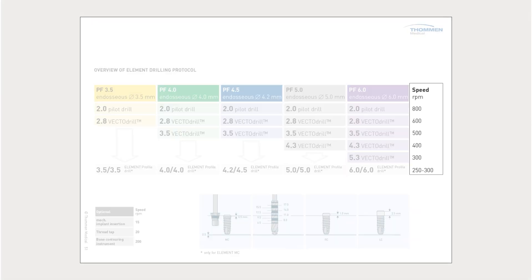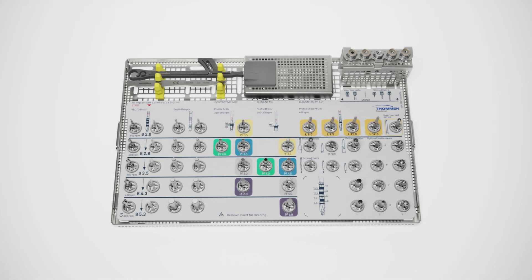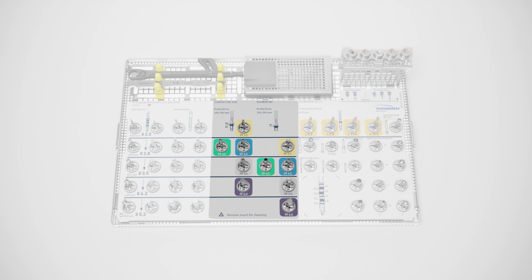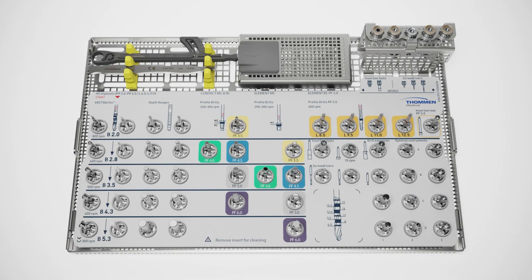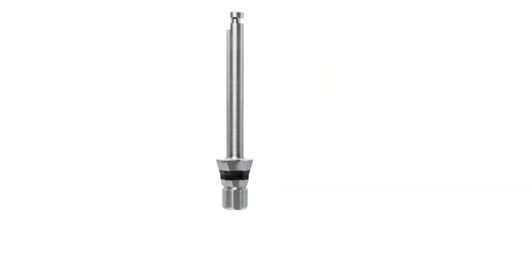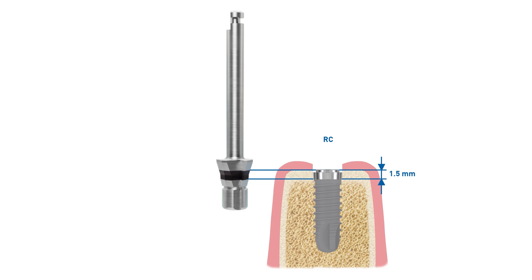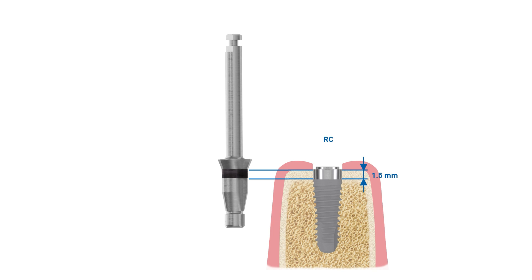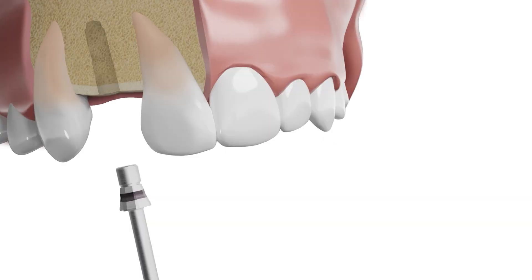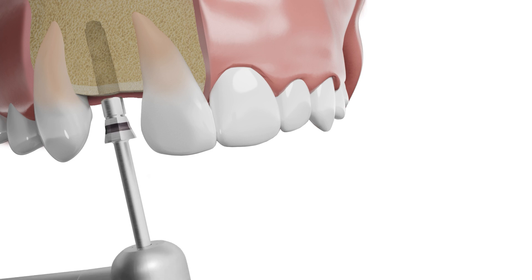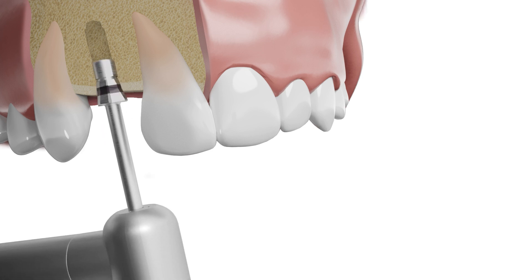While following the drilling protocol, please adhere to the recommended rotation speeds to avoid overheating and potential instrument fractures. Due to the varying design of Element and Contact implants, a corresponding profile drill for each implant line and platform diameter exists. Element implants only require profile drilling if the implant collar is placed subcrestally to ensure enough space for the prosthetic solution. Generally, the design of Element RC implants allows for a flexible insertion depth. Cone-shaped Contact implants always require the use of a profile drill. Continue by using the Element Platform 4 profile drill to ensure enough space for the subcrestally placed implant collar.